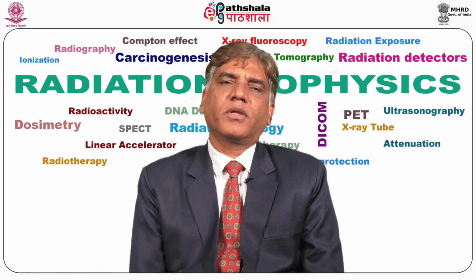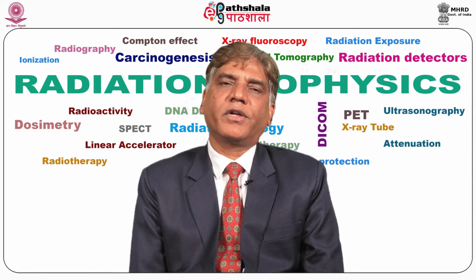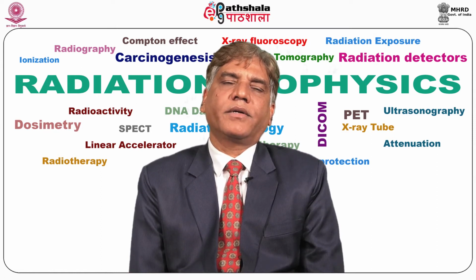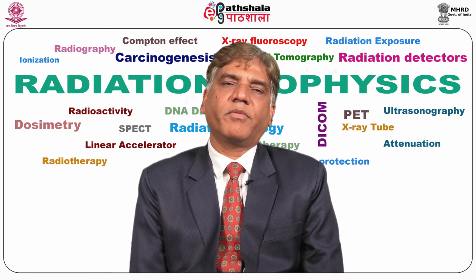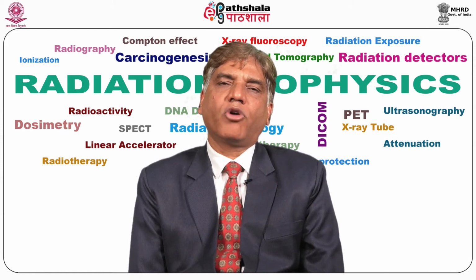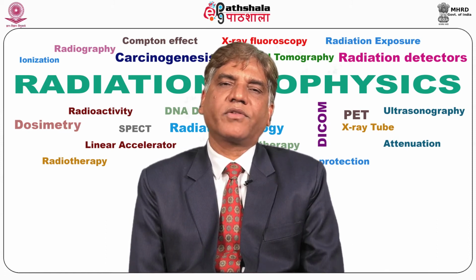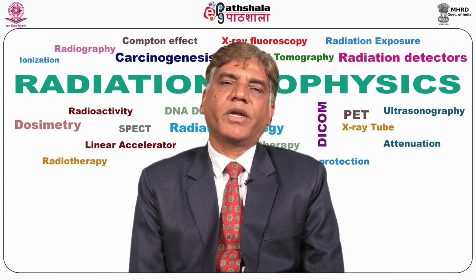As I told you, for the conversion of latent image into visible image, the cassette is put into the reader and the IP is removed mechanically from the cassette. Then the imaging plate is scanned by a laser beam. I told you about 750 nanometer of wavelength, and a deflecting device such as rotating polygons or an oscillating mirror deflects the laser beam back and forth across the imaging plate. The laser scans the imaging plate line by line in a raster fashion.